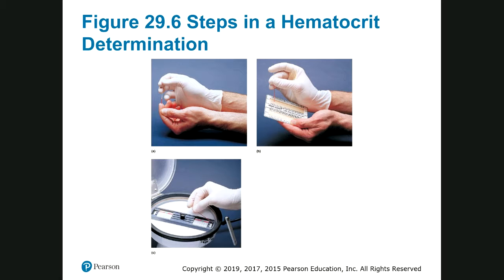If you put it in the opposite way, it will drop the blood inside of the centrifuge once it's centrifuged. This is a special centrifuge for those hematocrit holding capillary materials. After like 5 minutes in the centrifuge, with a special force, those little capillaries where your little blood is are centrifuged.